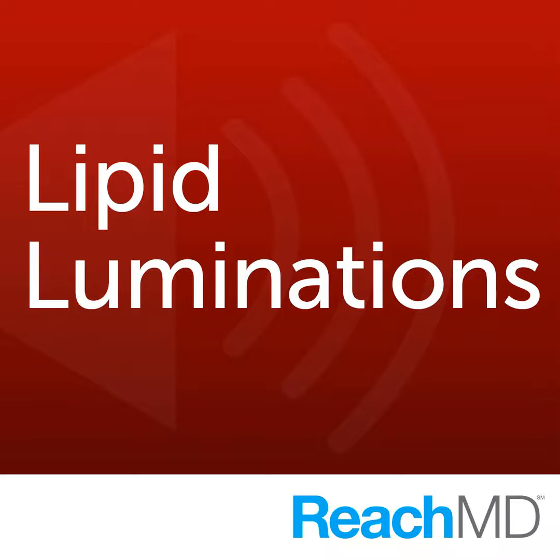Okay, well, that's a good segue. Let's talk a little bit about what were the major points of the appropriateness criteria. In whom should we always order this test, and in whom should we never order the test? They addressed a couple of major groups in the appropriateness criteria, and one was just patients in general at risk for cardiovascular disease, and the other was patients with metabolic syndrome.